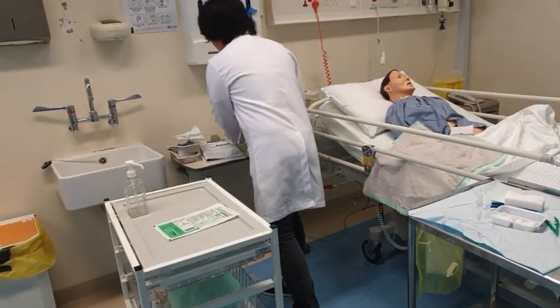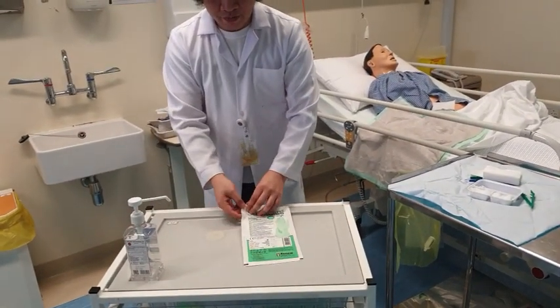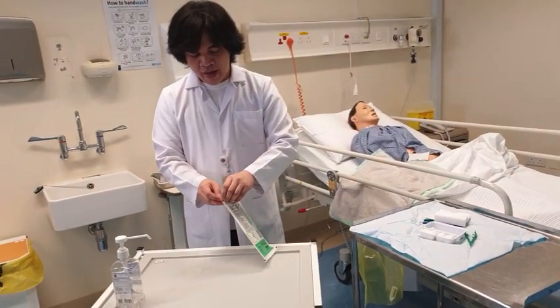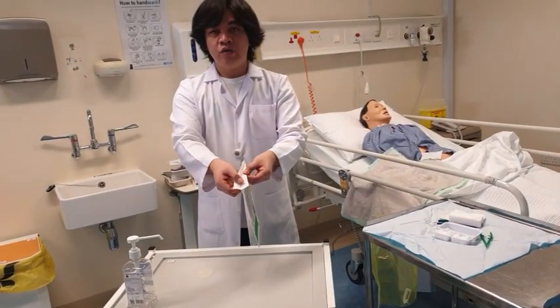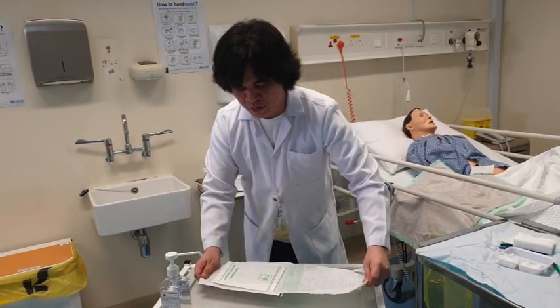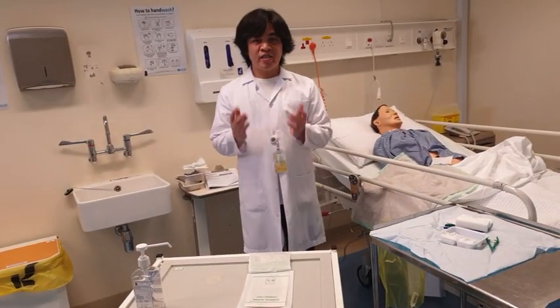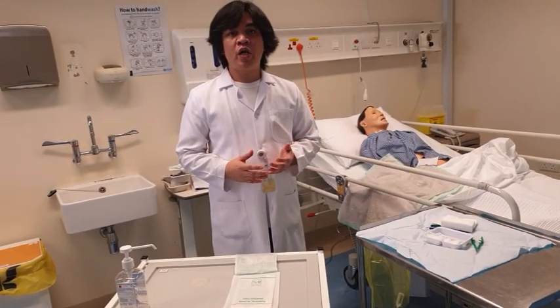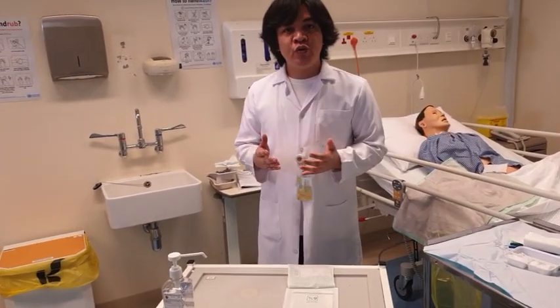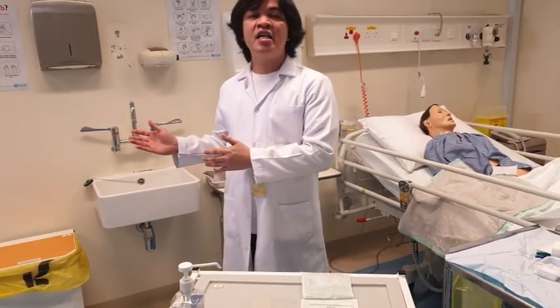So at this point, I'm going to prepare the gloves here. These are the sterile gloves that we have. I'm going to open the package, again using the flap. Open it like that. Okay? And the gloves are exposed. So at this point, before we start the procedure, I need to perform surgical hand washing, which I'm going to show you in a separate video. I'm going to have a separate video on surgical hand washing.